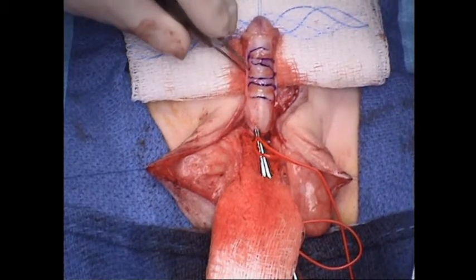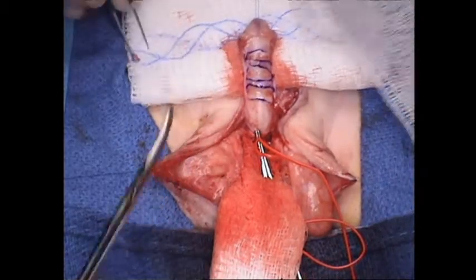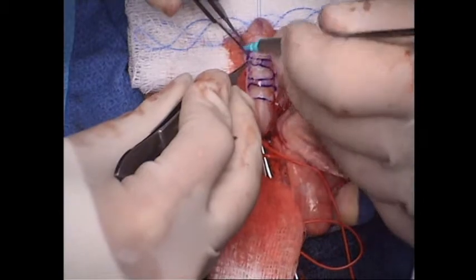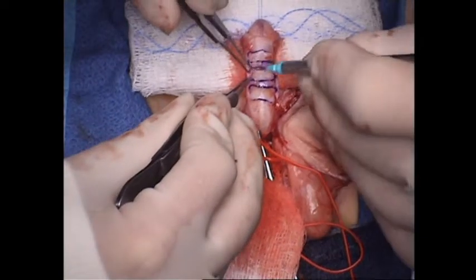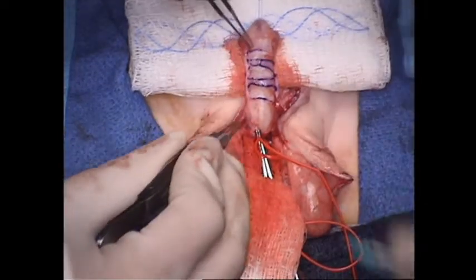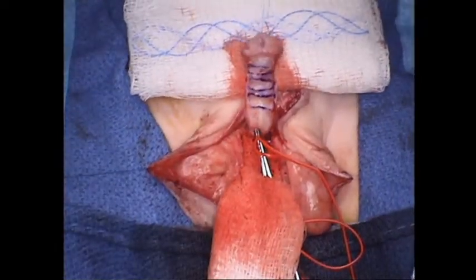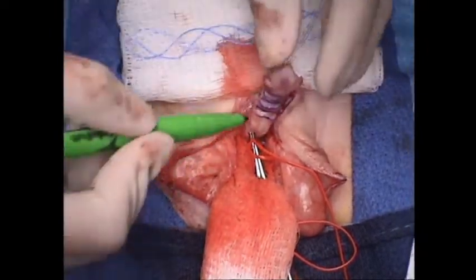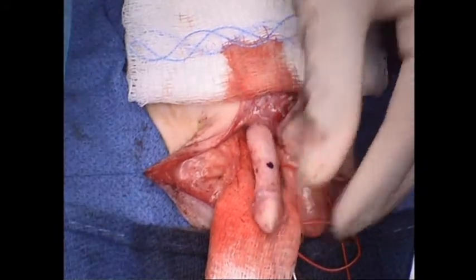But you saw that it was mostly straight. And it may just be this dartos tissue here. Yeah, but right here is just a little bit more. And generally speaking, that increase is about a centimeter. So that gives you a couple of different ballpark figures of when to stop your corporotomies, when you've reached that centimeter mark.